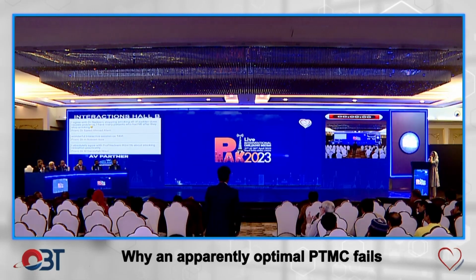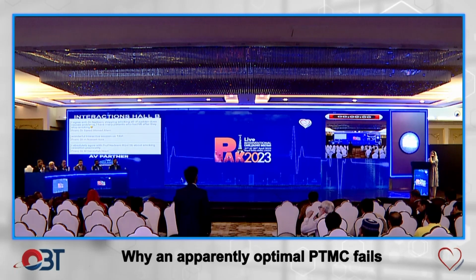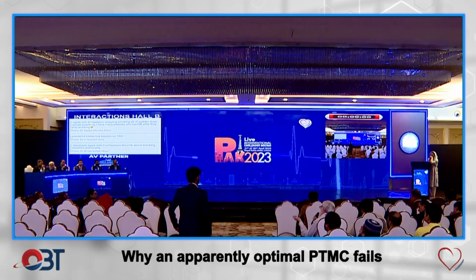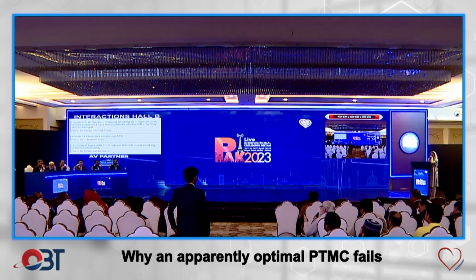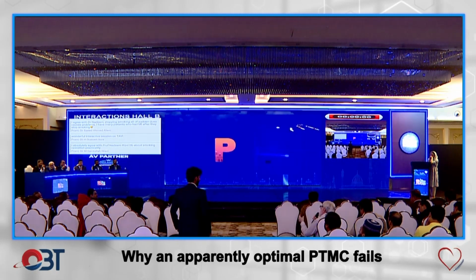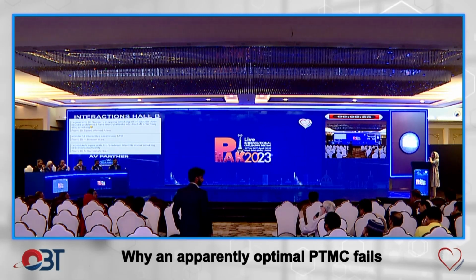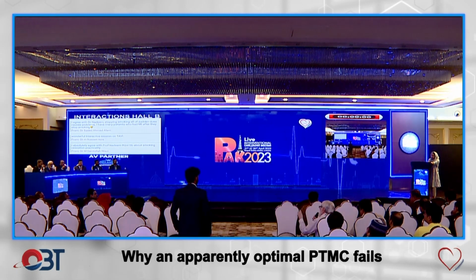Actually, what happened in the middle, the balloon came out even out of the LA. And then we brought the echo, and I just reviewed. They were doing the echo because the gradient was not down on the monitor. So they brought the echo and looked for the gradient, which was still up. And I was reviewing on the monitor, then I saw the calcium, and the balloon was well down the calcium into the LV.